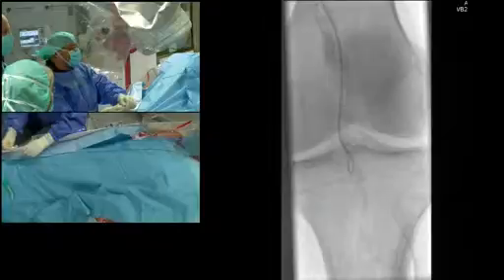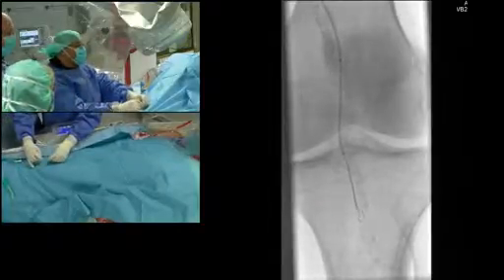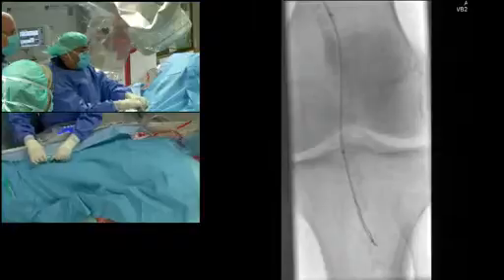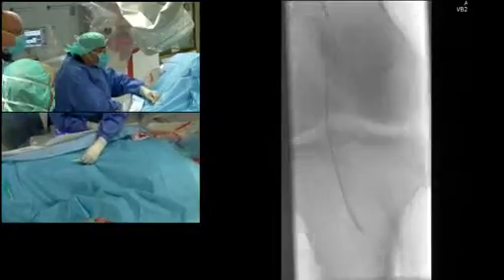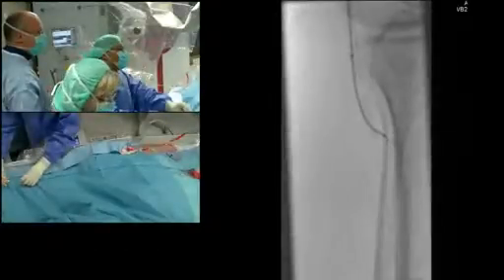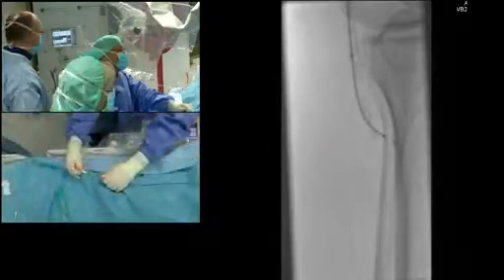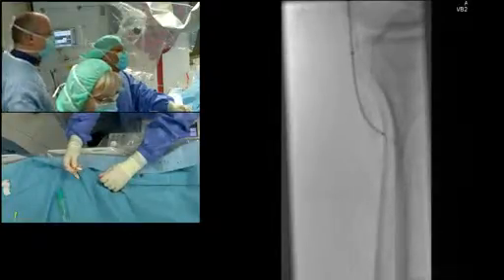As you can see, I'm using the cutter. So, subintimal or intraluminal? Yes, should be subintimal, but we have flow. Marco, what do you think of putting in the Aero GPS now?